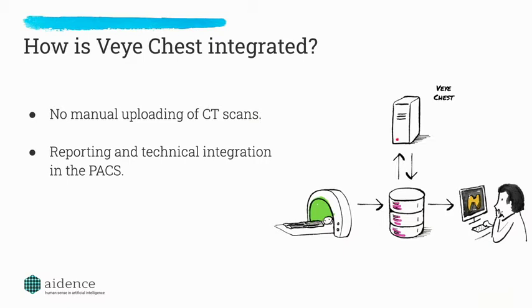So I'll explain a little bit about how it works in the workflow and how it's integrated. Something at Aidence that's very important to us is understanding radiologists' pre-existing workflows and making sure that the medical device that we're developing actually fits into their workflow and doesn't add work to their already very busy day.